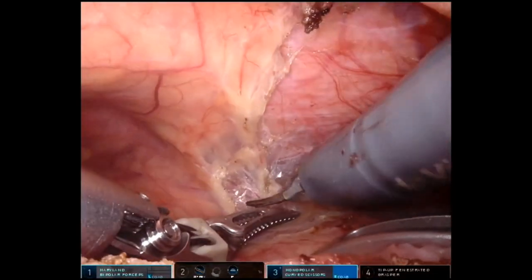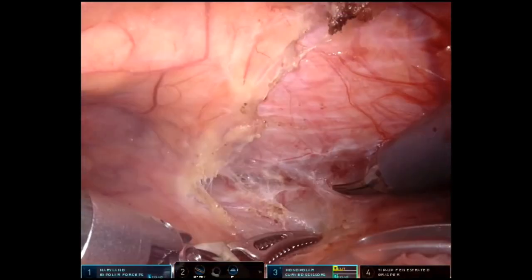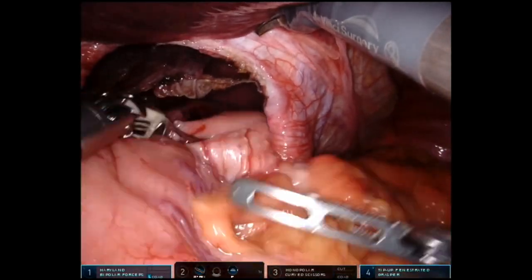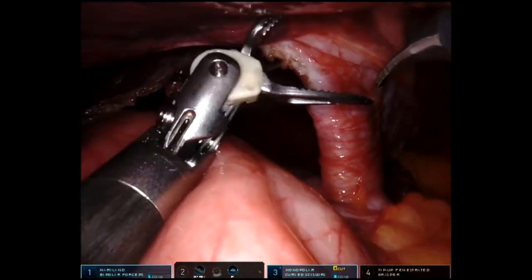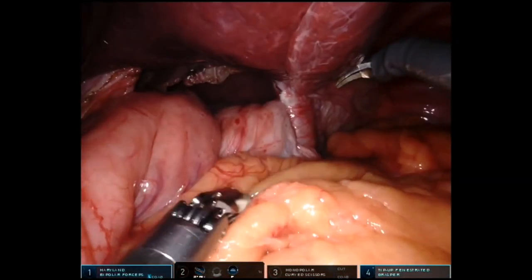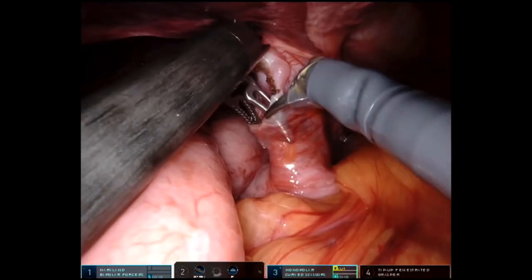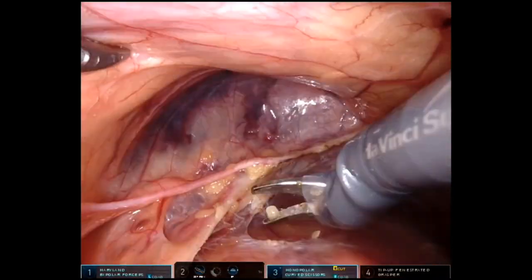You have the heart laying up top, the aorta laying below, and the lung cavity on both sides, so we like to be precise about where we are. We're pulling more stomach into the abdomen and continuing to take down that hernia sac, making an incision on the peritoneum around where the muscle fibers — the crura of the diaphragm — are, because those are the muscular layers we're going to close at the end of the surgery to close that hernia defect.